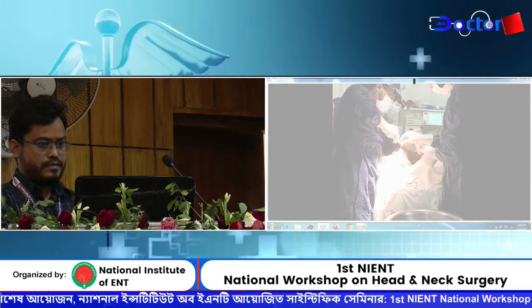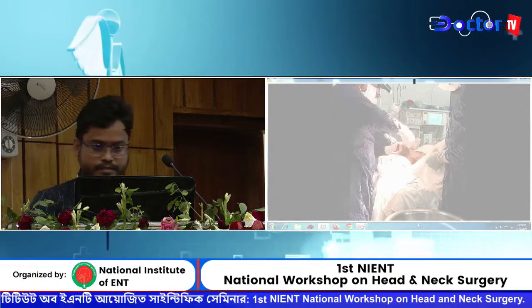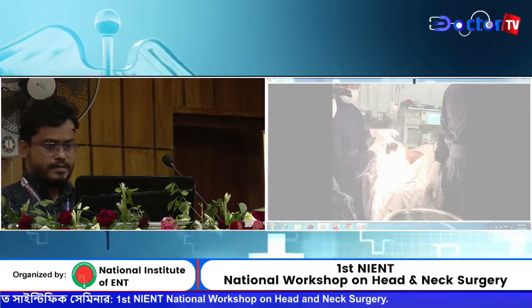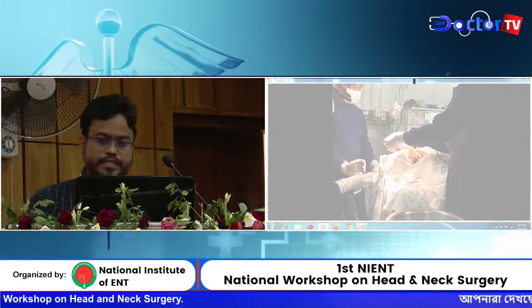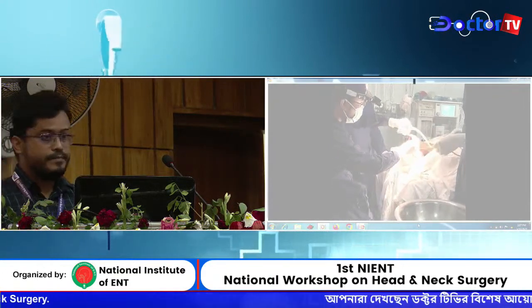Yes, finally we have done it. Now it's time for the lateral port, just lateral to the canine teeth to avoid injury to the mental nerve.